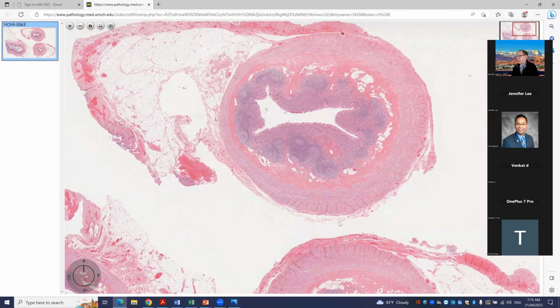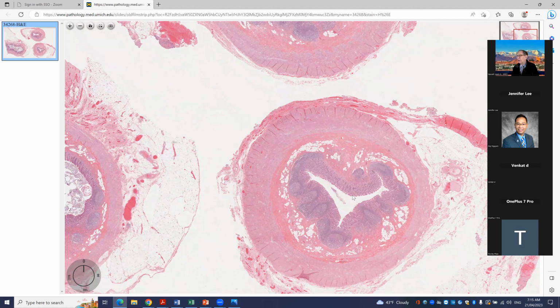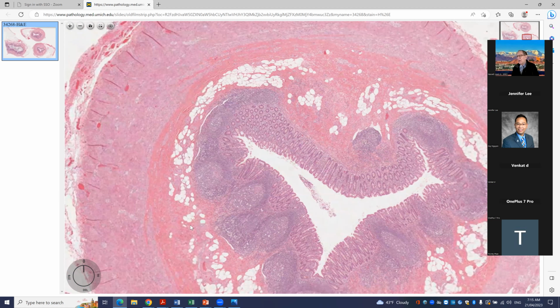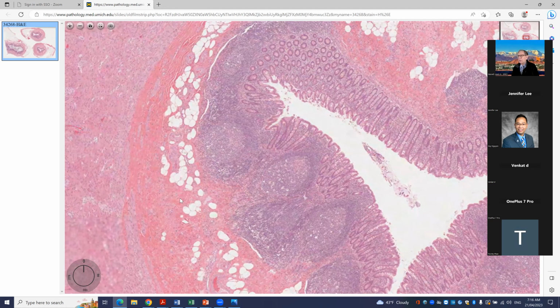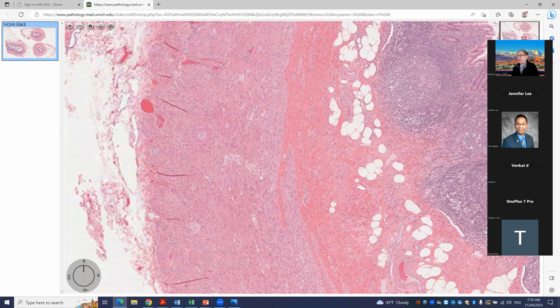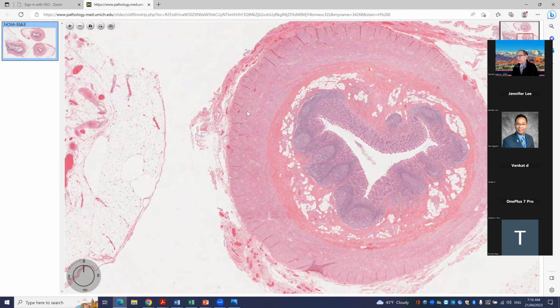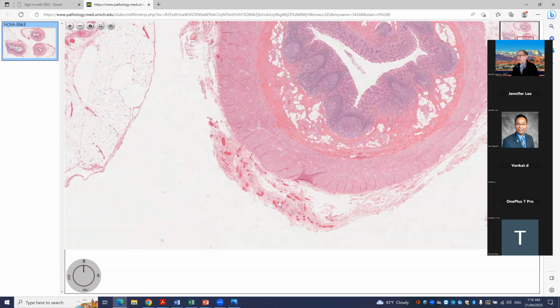We see that the mucosa has a fairly normal architecture of colonic type glands, lymphoid follicles, some submucosa with maybe a little bit of fibrosis here. You see a little bit more fibrous tissue than sometimes you see, but probably that's within the realm of normal. And not much in the way of inflammation here in the wall. And so we wonder if the patient really had appendicitis. Would we just sign this out as normal, go on to the next case?